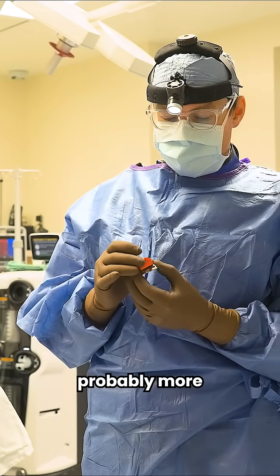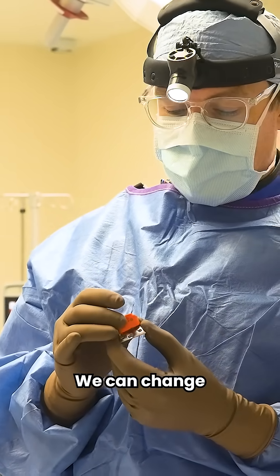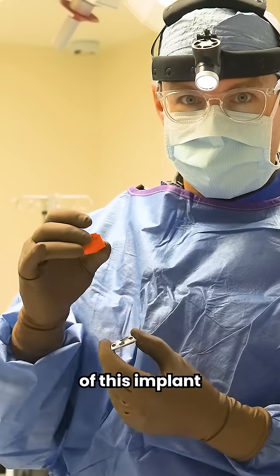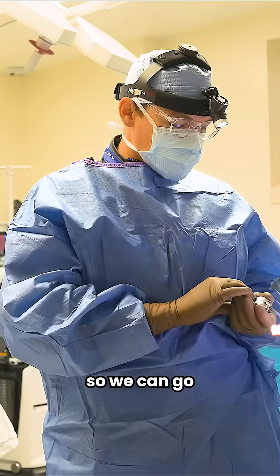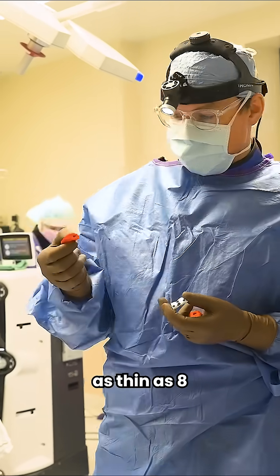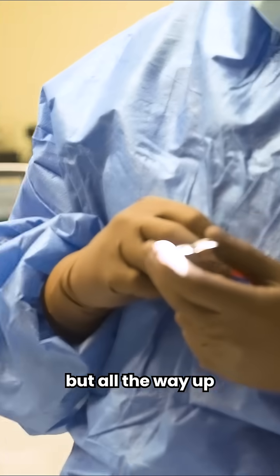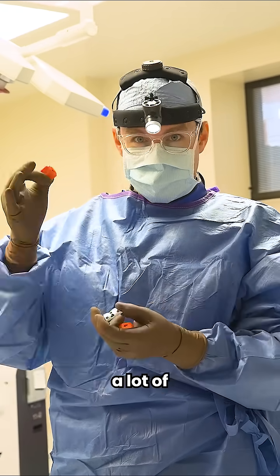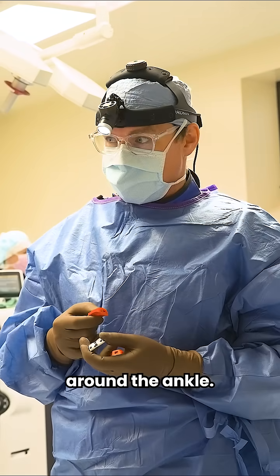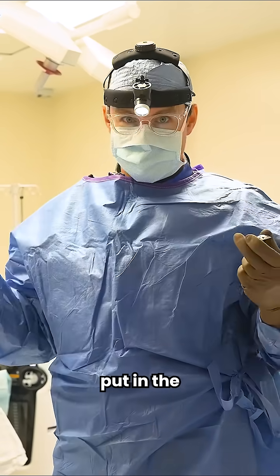Specifically, more than anything, it's this plastic insert that allows the ankle to move. We can change the thickness of this implant to provide either more or less tension — going as thin as a 6 or 8 millimeter poly, all the way up to a 12 or 14 millimeter poly, which provides a lot of different tension on the tissues around the ankle. This allows us to dial that in before putting in the final implant.